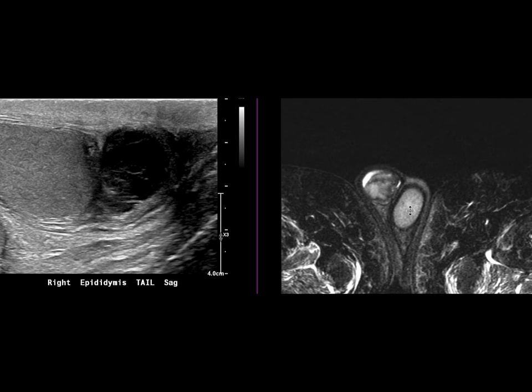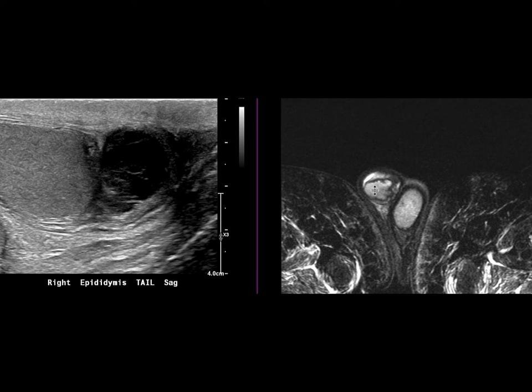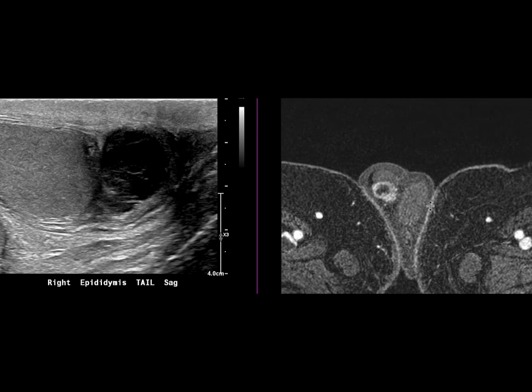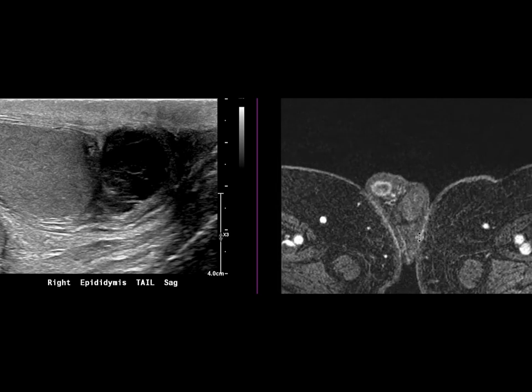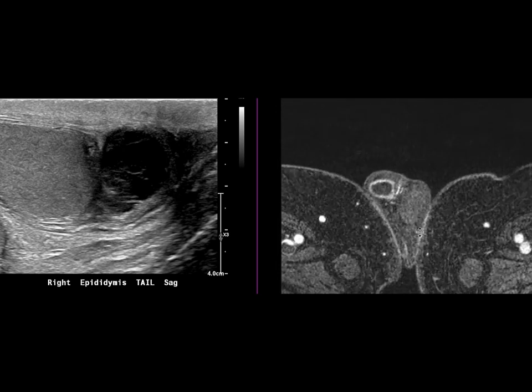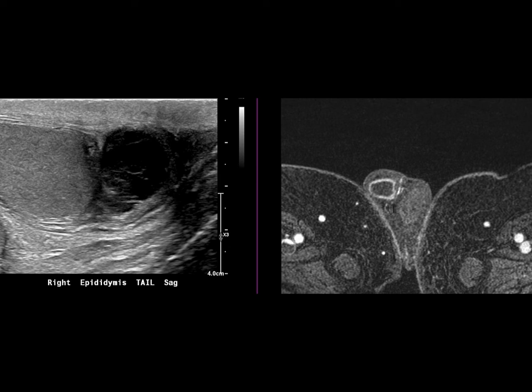you can see that complex collection with thickened borders and some hyperintense intermediate T2 signal within it. On the T1 post-contrast images with fat-sat, you can see there's a thickened hyperenhancing peripheral rim associated with it.